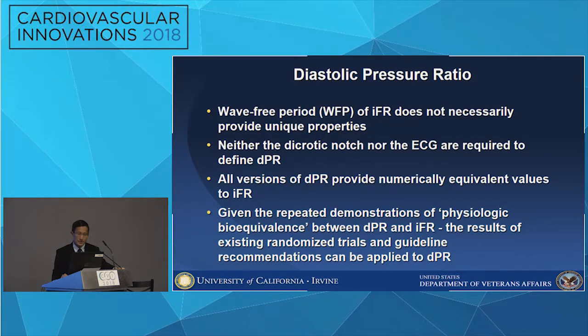So to summarize the diastolic pressure ratio, the conclusion is that the wave-free period of iFR doesn't necessarily provide unique properties, and you don't need the EKG to define it. And all versions of DPR provide numerically equivalent values to iFR. And so if it's numerically equivalent, then you don't need to do another outcome study.